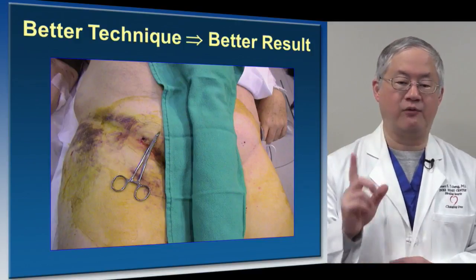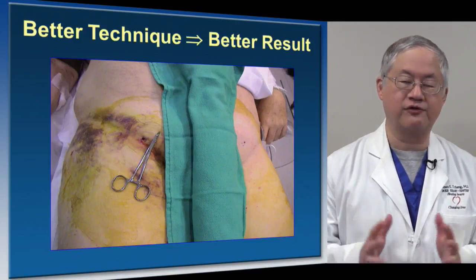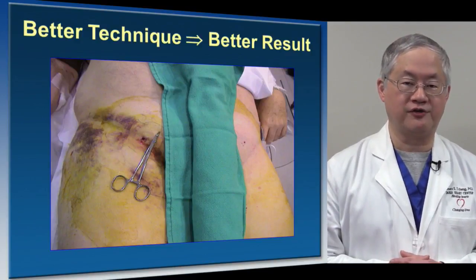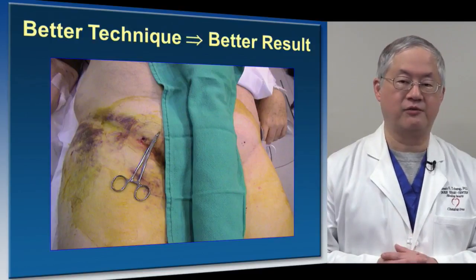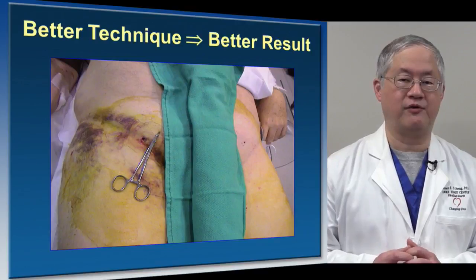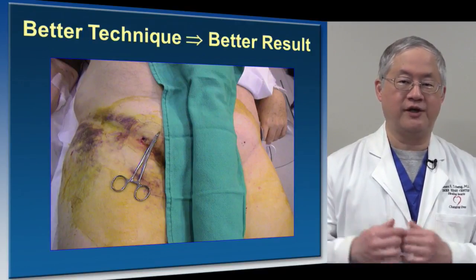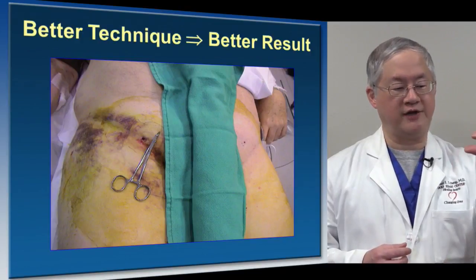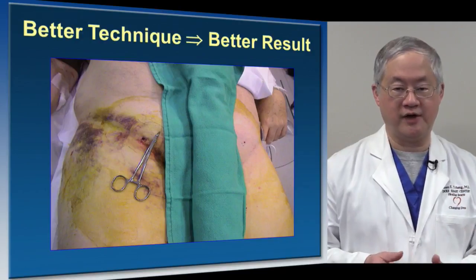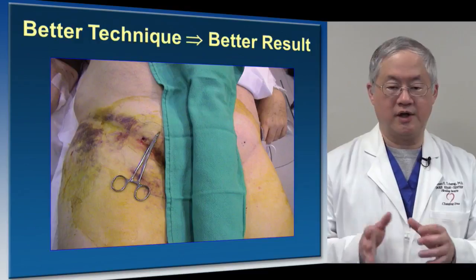Before I close, let me add one parenthetical. I've talked almost exclusively about femoral arterial access. I do want to mention femoral venous access. The Seldinger technique really isn't any different, but the location where you should access the femoral vein is a little different. Here, the inguinal crease is the place that seems to work the best, because that's the least distance between the skin and the femoral vein. As everybody knows, the femoral vein is more medial than the femoral artery.